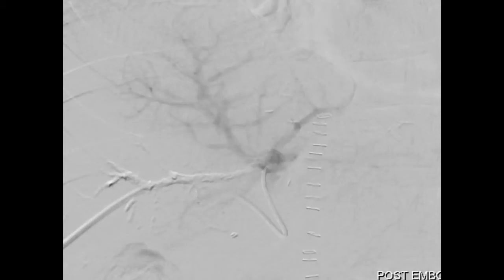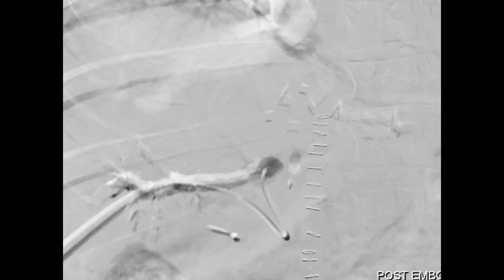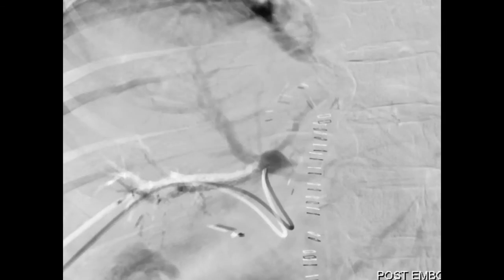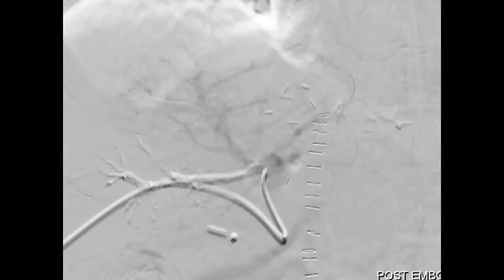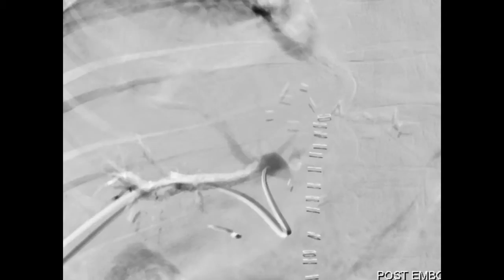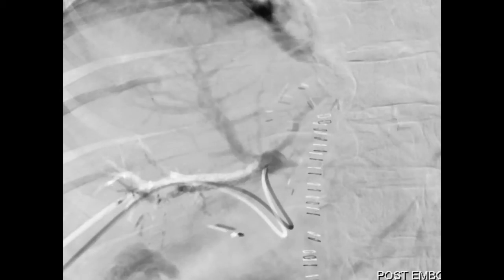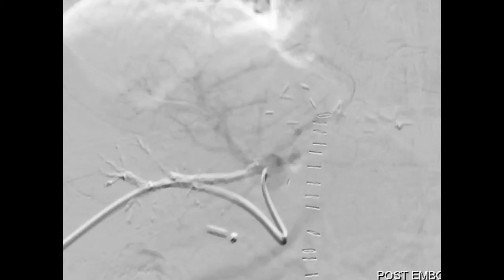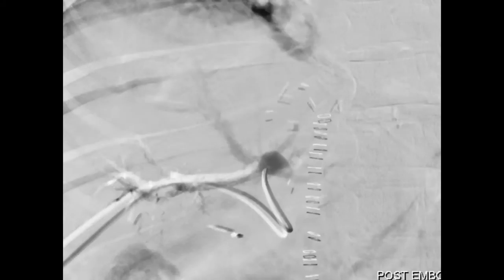Usually I use a mixture of lipiodol and Glubran using either a 1:1 or 2:1 ratio depending on how liquid it needs to be and how far you need to go into the liver. Glubran being very aggressive with both syringe and catheter, you have to inject quickly into your catheter. Very important, you need to have many syringes filled with 20% glucose in order to flush the catheter between each injection. You should not use normal saline to flush your catheter because then the catheter will be completely stuck.